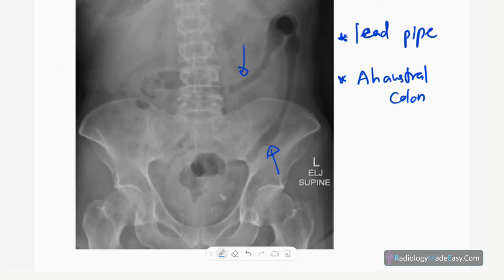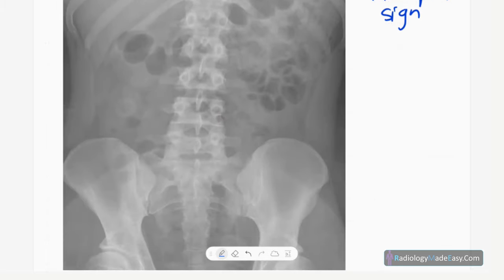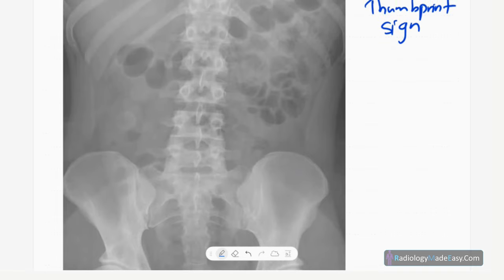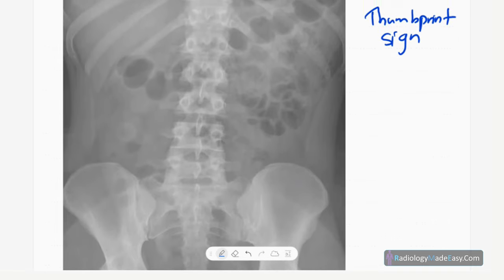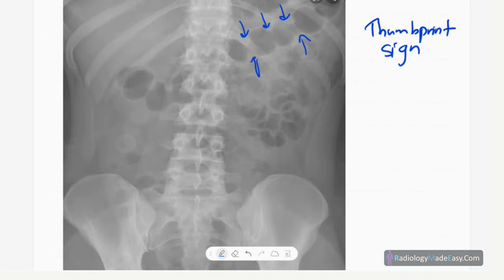In another abdominal X-ray, you can see thumbprint appearance due to thickening of the haustra, indicating bowel wall thickening. This is seen in the transverse colon, giving rise to the thumbprint appearance.